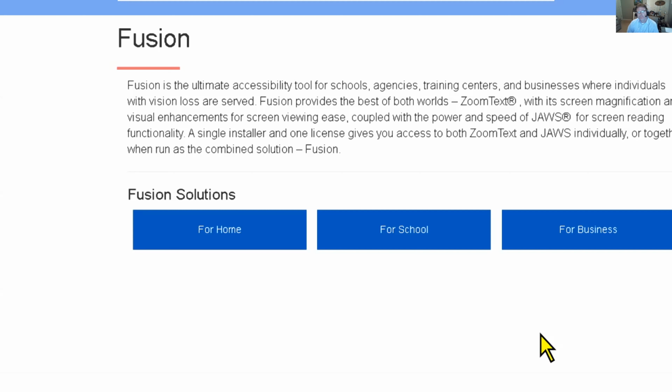We can definitely follow up later and give more information. Yeah, I have not worked with Canvas. I've heard a lot of good things about Canvas, but I haven't used ZoomText with it. So that might be one we want to follow up with someone who's used it with Canvas. And I know we're looking at doing some future webinars as well on working with different programs. That would be a good one.